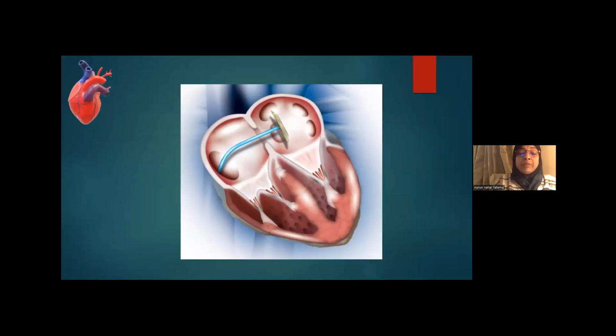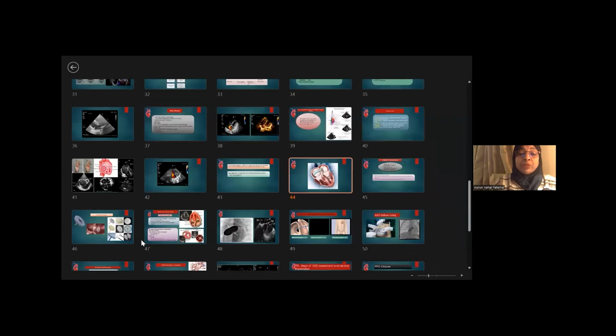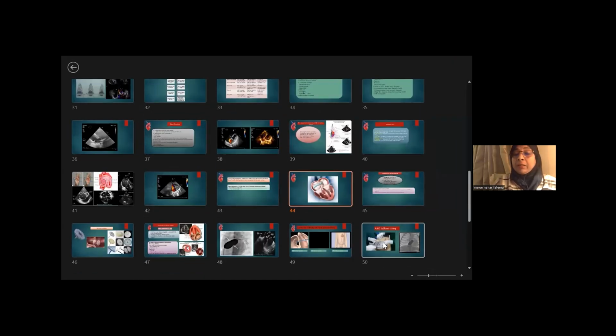This is the video of a device closure procedure. I think everyone knows about it, so I'm not going into the detail.